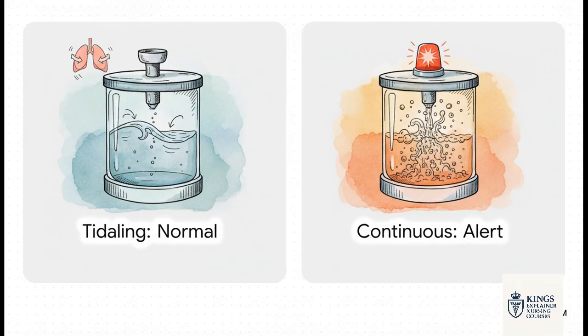First is something called tidaling. That's when the water level gently rises and falls as the patient breathes, up on inspiration, down on expiration. Like the tide. Tidaling is good, it's normal, it means the system is working.